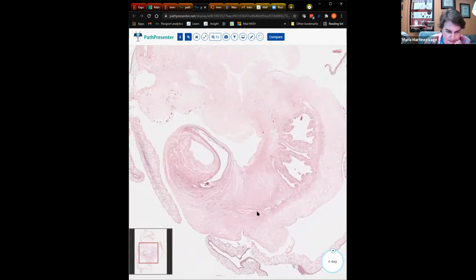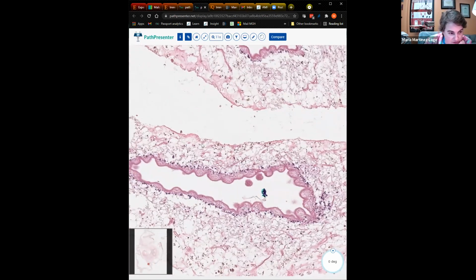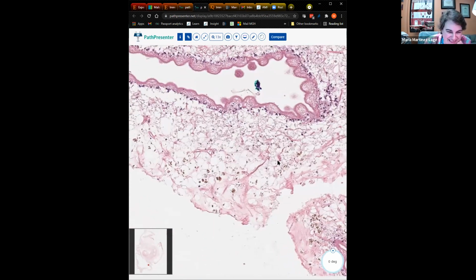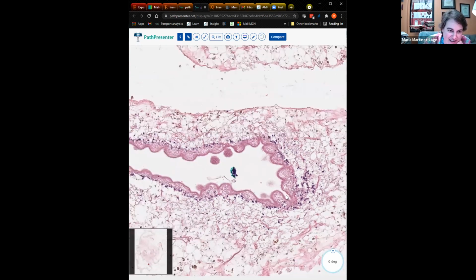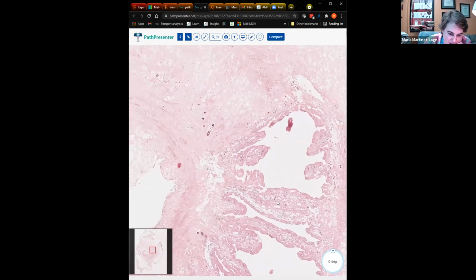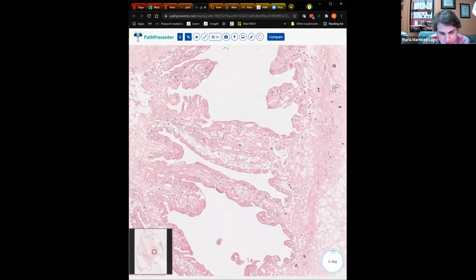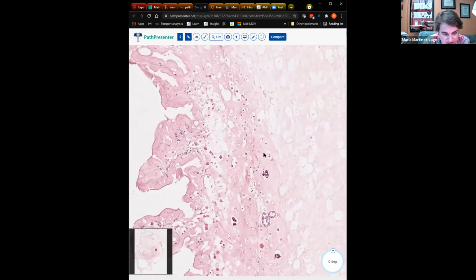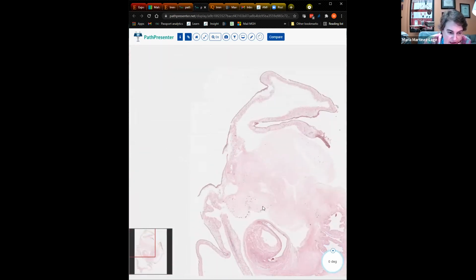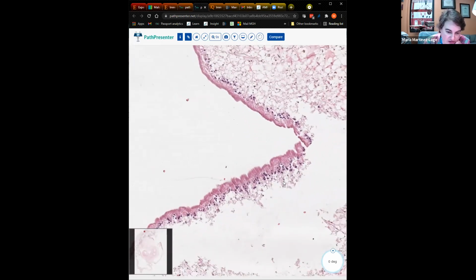And what we're looking for are these organisms that have a very typical non-neuropil-like histology. In this example, it looks like we have an organism that is in the process of dying, where you can see the internal organs here, but it seems to be undergoing some degree of necrosis. And as you can see, there's already starting to be some calcification around it. I don't see a lot of brain around this particular cyst. So it might have been that this was actually an intraventricular lesion.